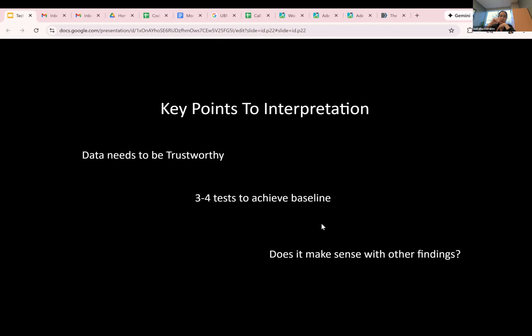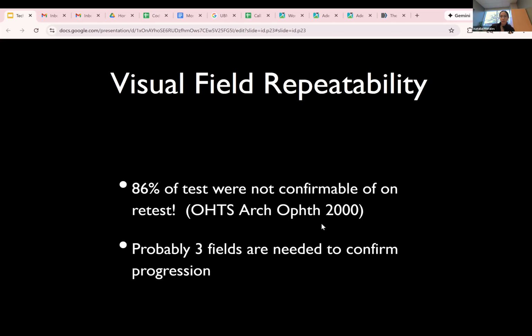And then for glaucoma, one thing that's really helpful is that we follow it with OCT RNFL and visual field changes. For an OCT RNFL, the traditional pattern is polar thinning. So if you have really bad superior thinning, I expect to see inferior changes on my visual field. And if I don't see that corresponding change, then that makes me wonder, is this a real change on my visual field, or is this maybe more testing variability? So that's another thing we use to confirm whether this data is true or not.